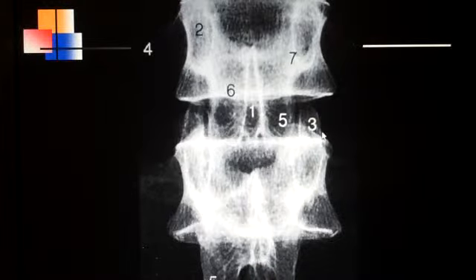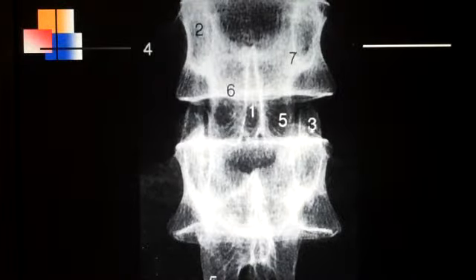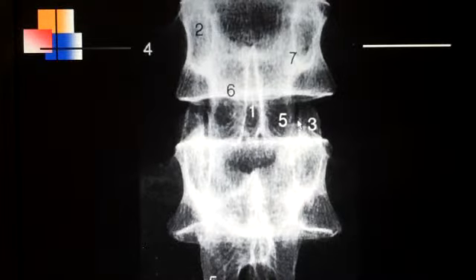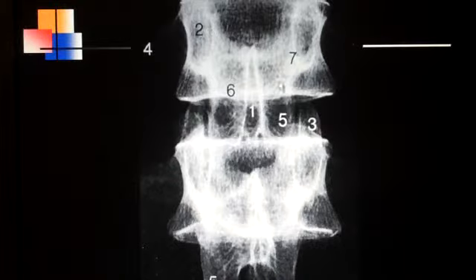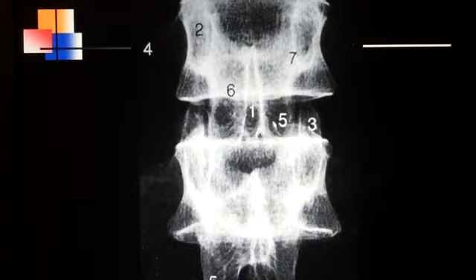Number three is the superior articular process — it goes up and comes down right there. You can see the joint space at the point of the arrow, called the apophyseal joint. Number five is the inferior articular process of this segment, coming all the way down, and all of that is the inferior articular process.